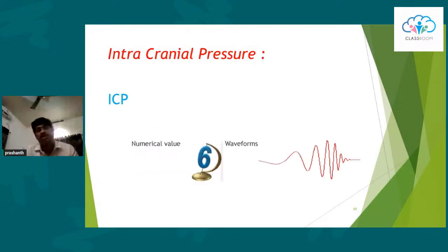Now we'll come to the core issue here. That is, how do you interpret this ICP? So there are two ways of looking at it. You can look at the numerical value of the ICP, or you can do a waveform analysis.